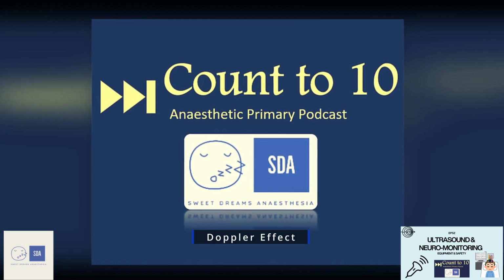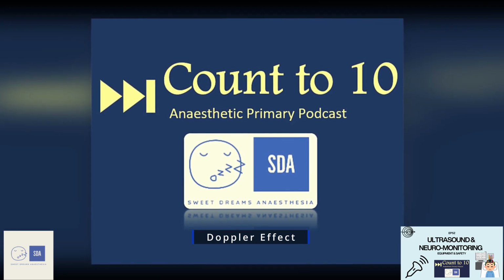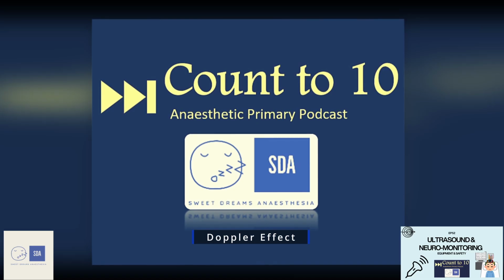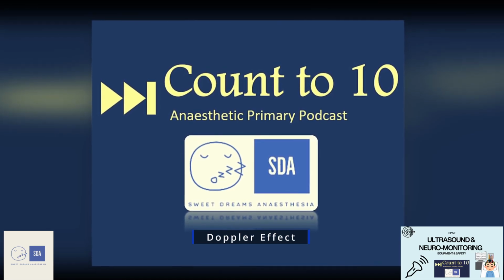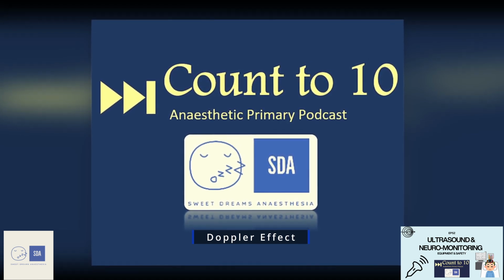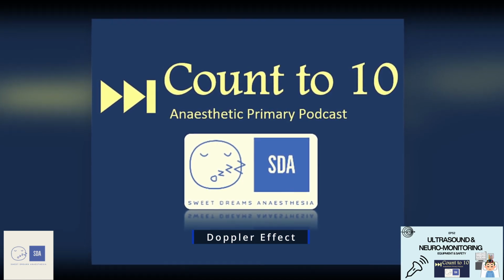And there's many ways to write this equation depending on what you're trying to figure it out for. If you're trying to work it out for cardiac output, you can say that the velocity of the object is equal to the change in frequency from emission to detection times the speed of sound divided by 2 times the emitted frequency, because you account for the round trip there and back, times the cos theta angle, which is the angle of incident at which the ultrasound beam hits the relative object in question.